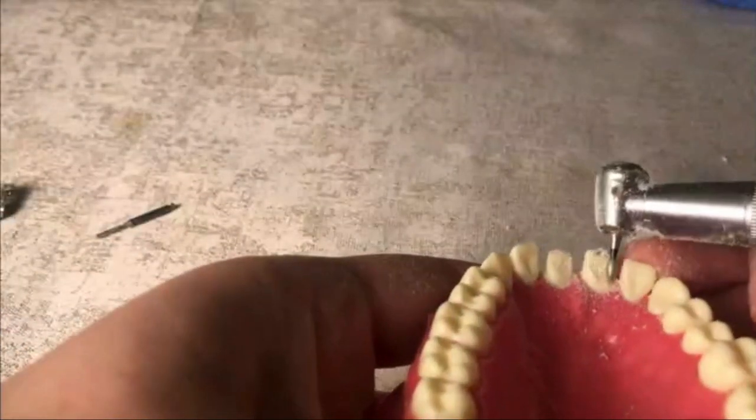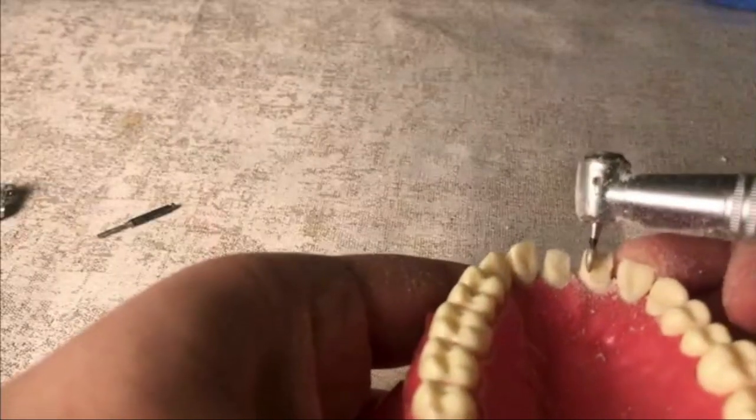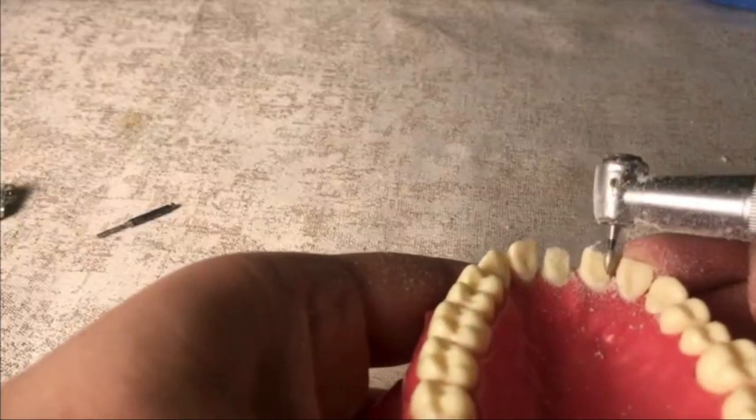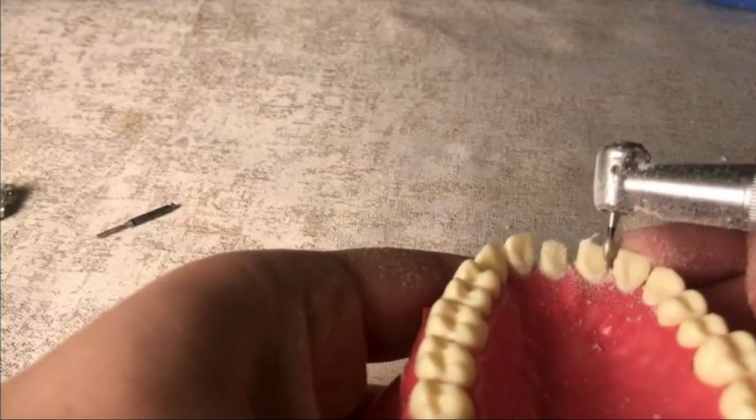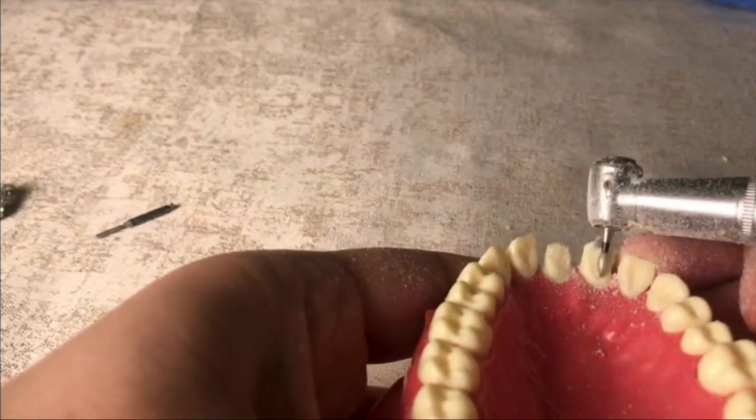We shouldn't lose the height of the cingulum here, in terms of the retention of the crown that we will make on it. If the height between the top of the cingulum at this step is less than 3 mm, the retention decreases significantly.